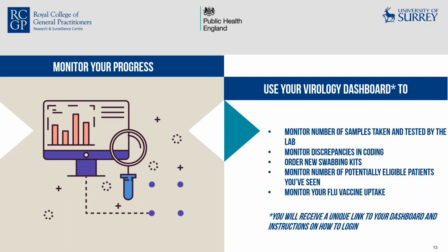Now, some of our practices who have participated in this study for years have shared a few ideas with us. We know that some of our larger practices run flu swabbing clinics to incorporate this study into their workflow during the winter season. And some practices have also used a cooler bag in their consultation room to keep the viral transport medium cold without having to run back and forth from the nearest fridge every time they see an eligible patient.